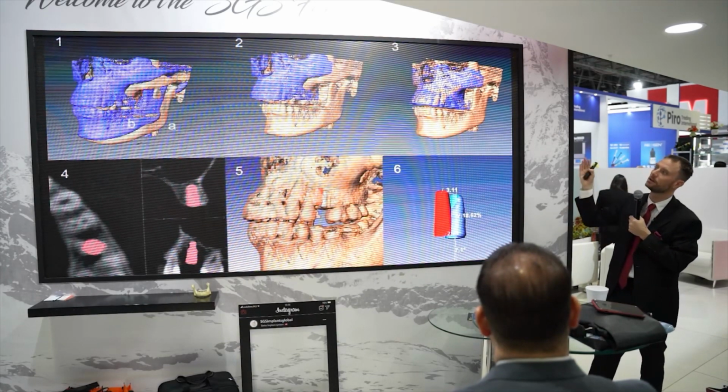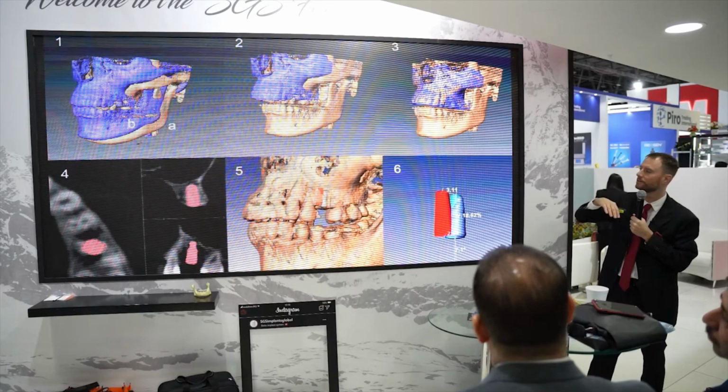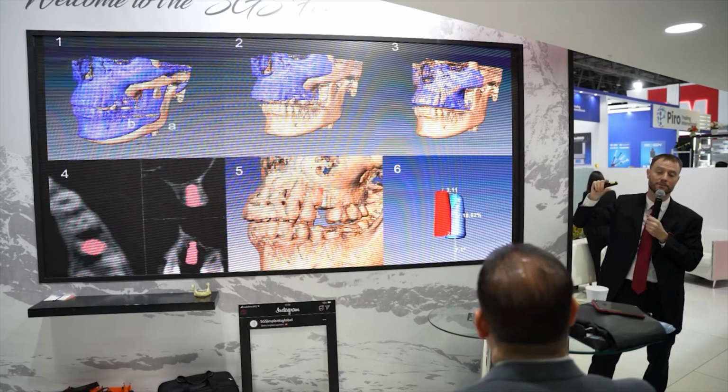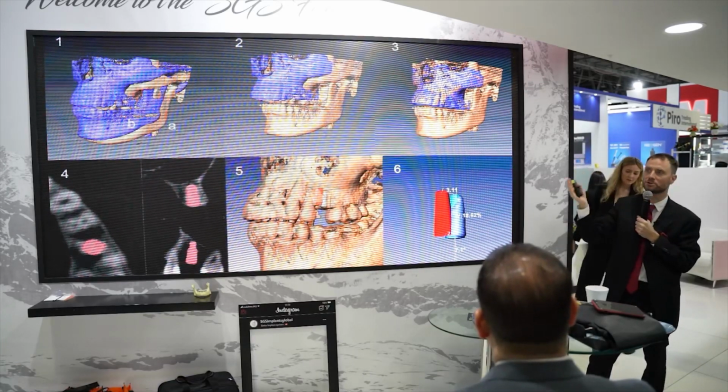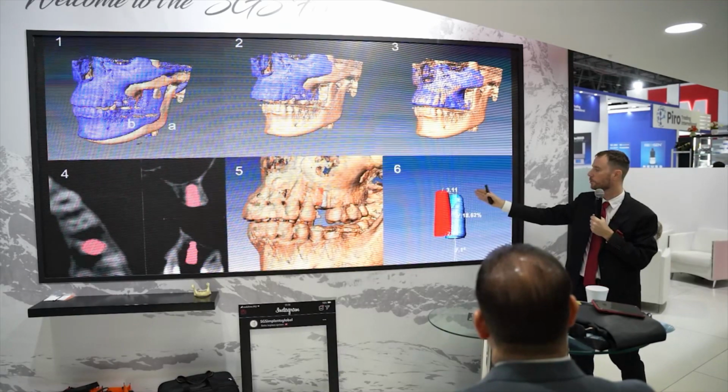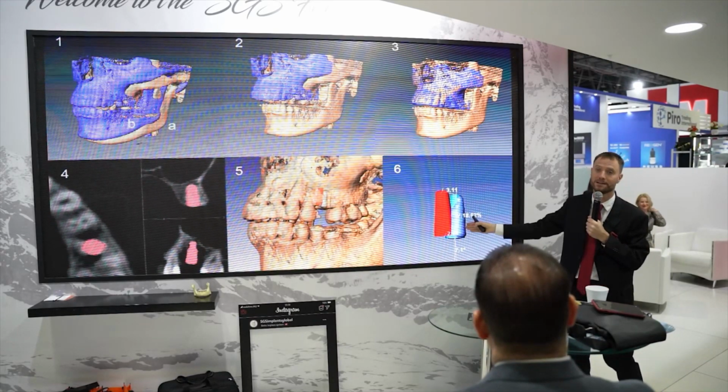What we had, after the implant placement, we had more than 220 implants. After the implant placement, we did the superimposition, we had the preoperative and postoperative CT, and we compared how much deviation we have, original and the final. So our plan and what happened.